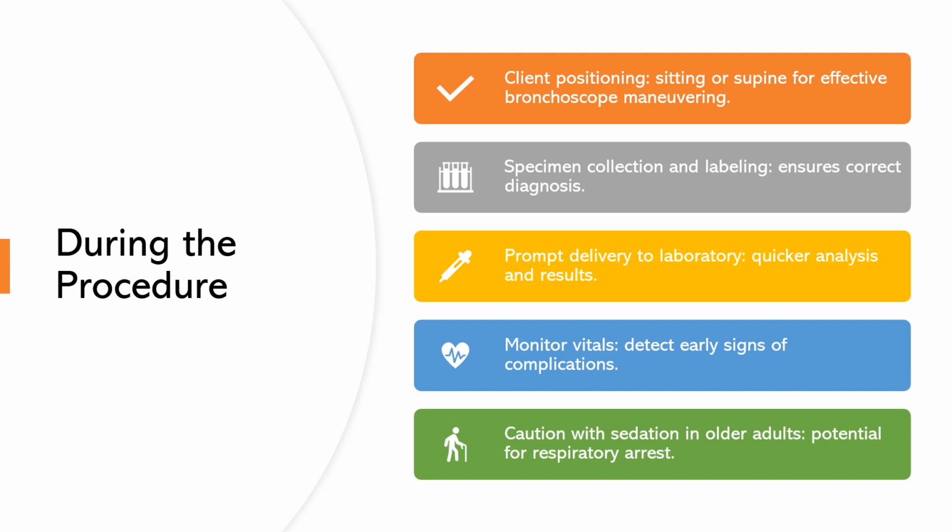Now, during the procedure, we're going to position the client in a sitting or supine position, and this depends on the provider's preference and the client's comfort. It's not all about comfort, though. Proper positioning is crucial for allowing the bronchoscope to be inserted and maneuvered effectively.